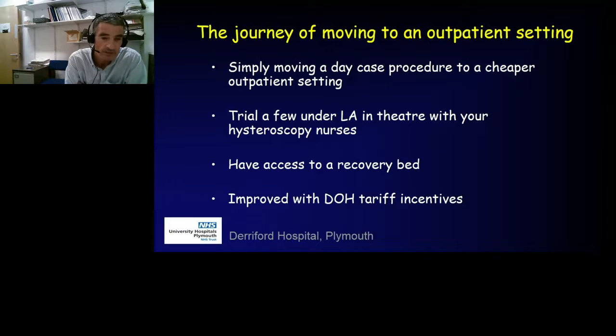Initially, we did some in the main theatre where we were doing them under general anaesthetic and used the local anaesthetic there. And we took our theatre nurse teams from the outpatients to there to learn the procedure and gain confidence. One of the main things we had to have was access to a recovery bed. And again, that can either be on the ward or in the outpatient setting in one of the other rooms. So we don't have a dedicated recovery area, but we've made do. And actually, it's very rare that we need to use that recovery bed, which is reassuring.